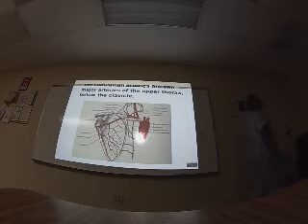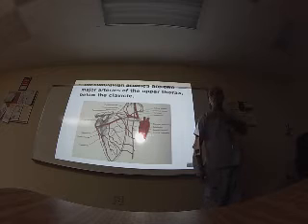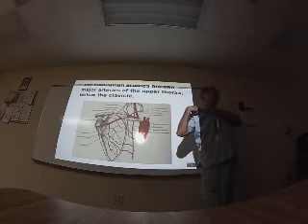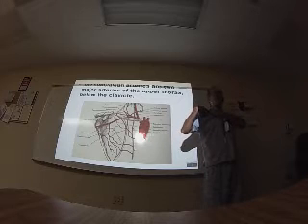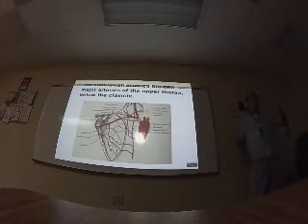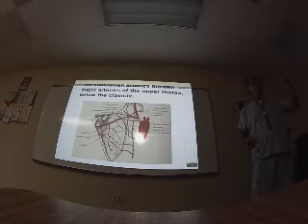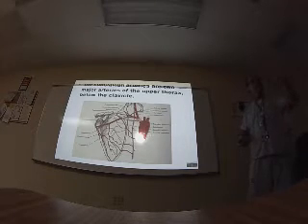The subclavian arteries are two major arteries of the upper thorax below the clavicle. Subclavian, below the clavicle. You must know how to scan it. You are scanning from the supraclavicular fossa or the infraclavicular fossa. This is an artery that they ask for in the protocol. It's not very important in pathology. Remember that vascular studies of the upper limb are not as common as vascular studies of the lower limb. But even one time a month or something like that, they ask to make an arterial or venous study of the upper limb, while the lower limb is something that you are going to scan every day.